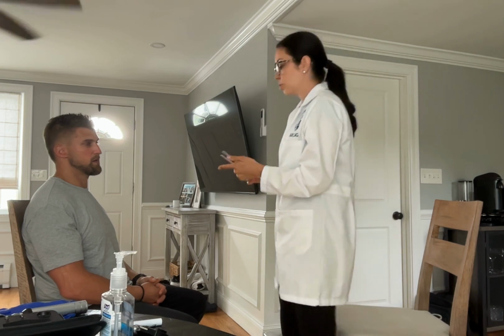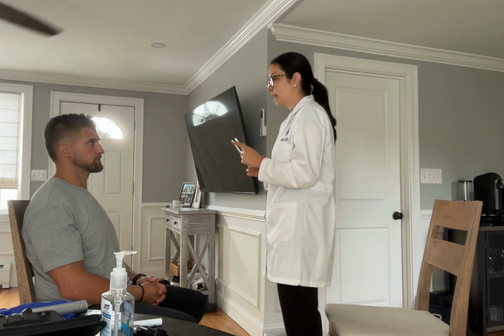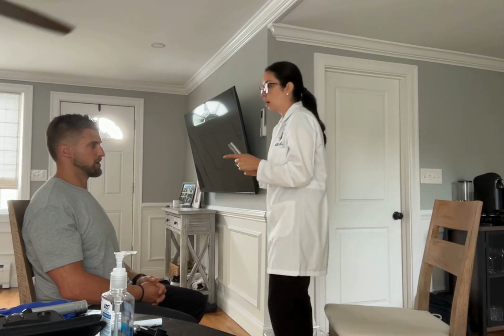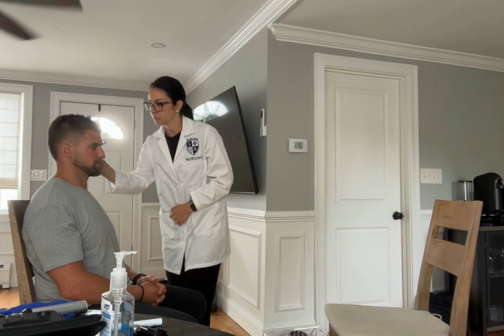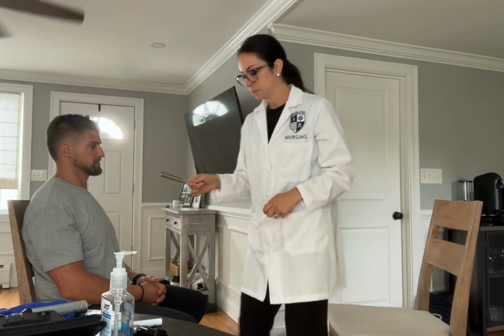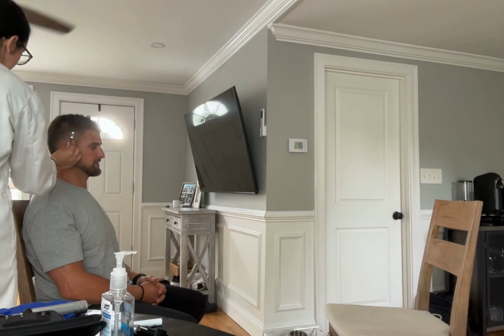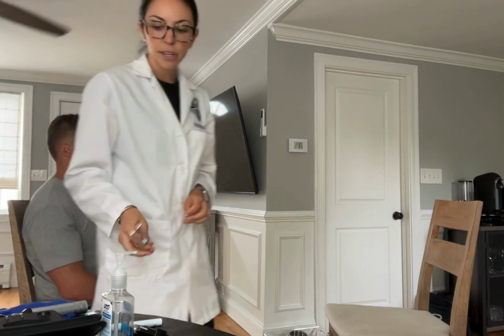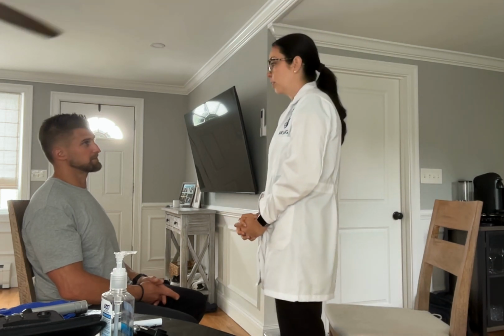So I'm going to strike this and I'm going to place it near your ear and let me know when the sound is most loud. Okay. The beginning. Okay, and do the other ear. Beginning. Okay. No hearing loss. Okay, and that also assesses the vestibulocochlear nerve.